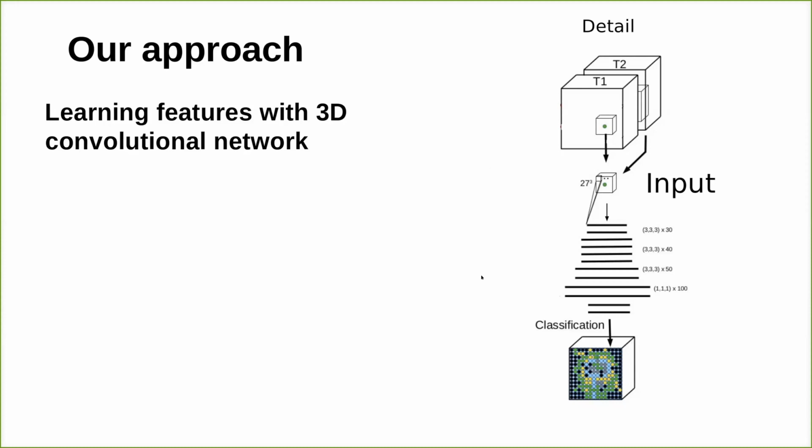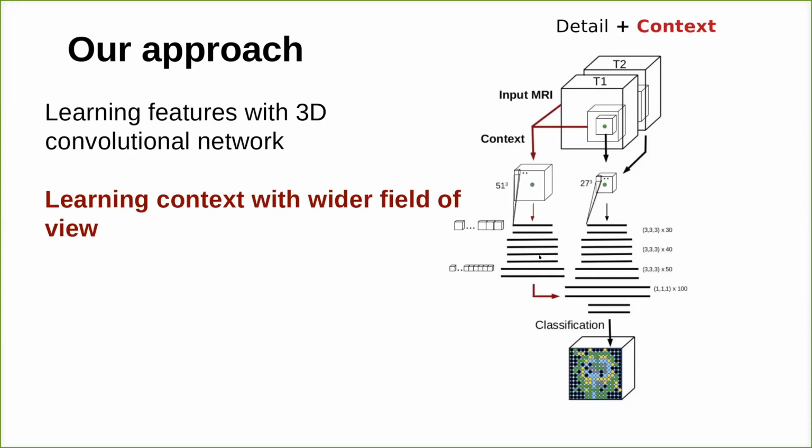To this, we can add different modules that are independent from this initial basic model that we call the detail model. Secondly, which is also common to increase surrounding information, we add what we call a context model. In this case, we take a larger, low resolution surrounding patch to alleviate computing resources. So this adds extra surrounding or context information. At this point, this architecture is analogous to another existing architecture called DeepMedic, which is also a very successful biomedical segmentation tool.